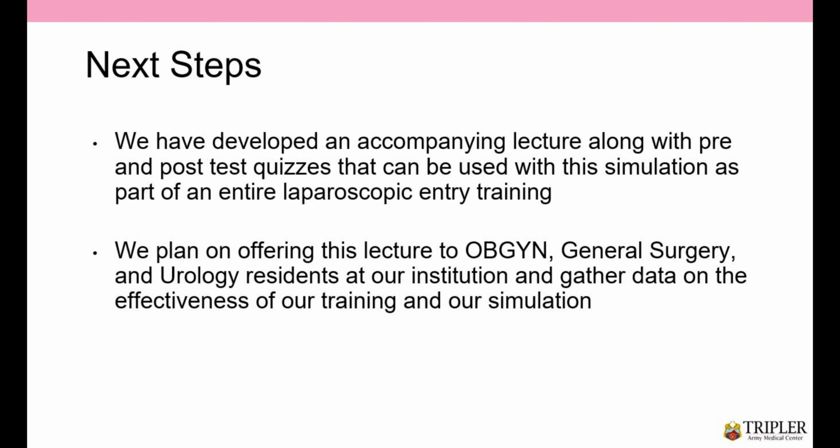Going forward, we are working to develop a simulation program that can be easily reproduced at residencies across the country. We have created a pre- and post-test, which assesses laparoscopic medical knowledge and gauges student comfortability and experience with laparoscopy. We have also created an accompanying lecture that reviews relevant surgical anatomy and laparoscopic entry techniques. We believe that our simulation, in addition to the lecture and tests, will better prepare residents in surgical specialties, including GYN, but also urology and general surgery.